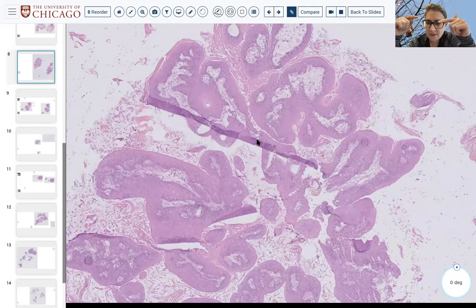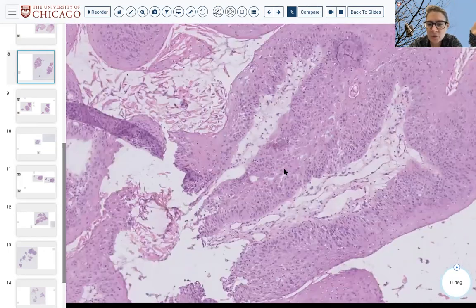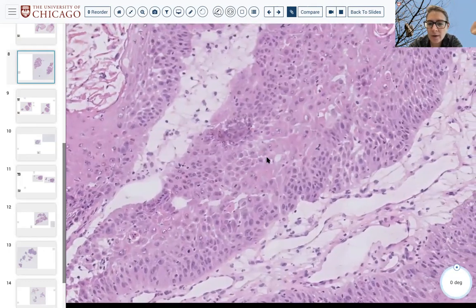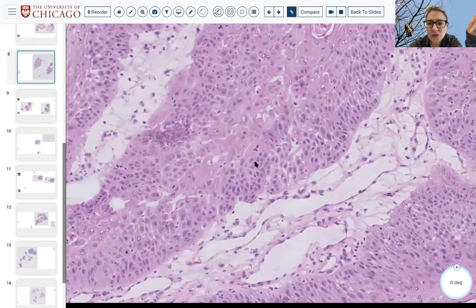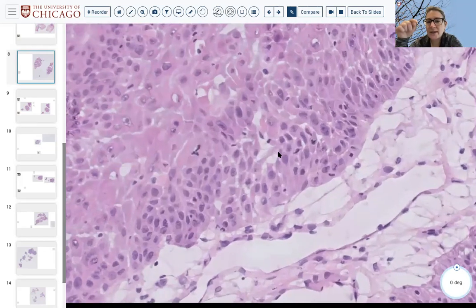More importantly, at the time of frozen, you kind of want to start from the worst, or the lowest. Be like, is this something or is this nothing? Is this a benign squamous papilloma or non-lesional hyperplasia, like you're saying, or do I care about this?